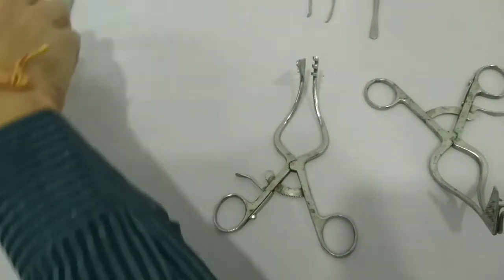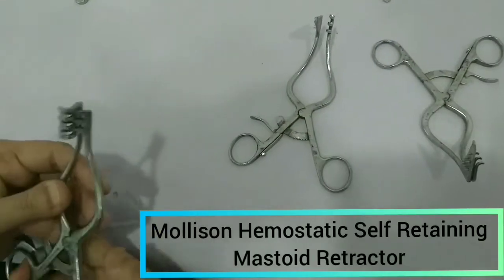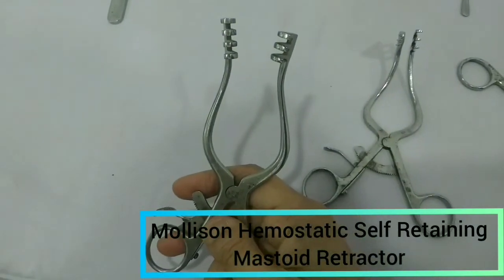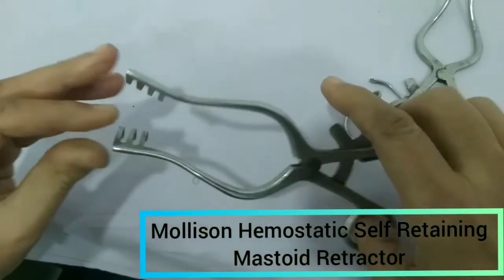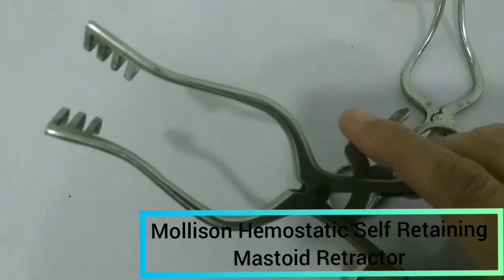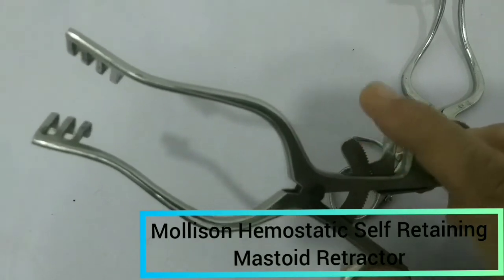After elevating, we will use the retractor. The most commonly used retractor is the Mollison's mastoid self-retaining hemostatic retractor. It will separate and keep the two margins of the incision apart, and will put pressure on the flap. That pressure will not allow the vessels to bleed, and that is why it is called hemostatic and self-retaining.